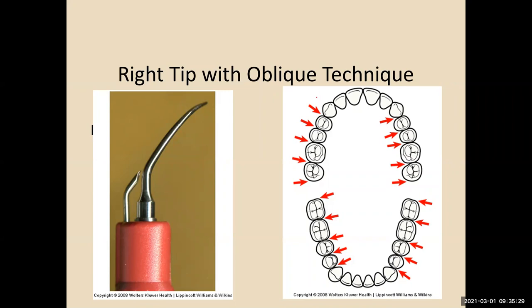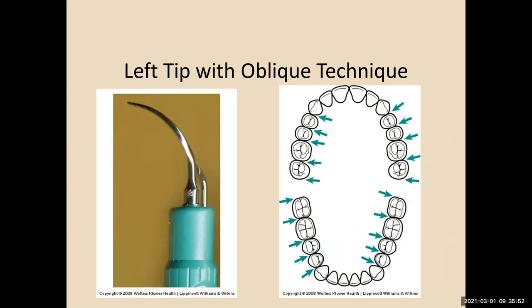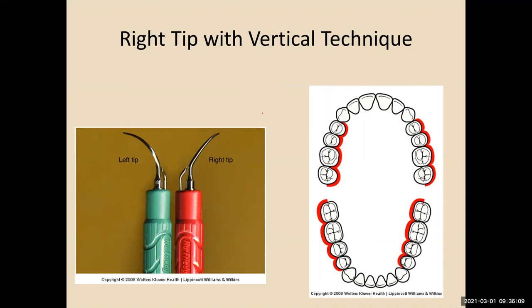So similar to your curette, if you can use it on the buccal of the posterior on one side, you can use it on the linguals on the other without having to flip it, like your universal curette. You might see some students have a poster or a little piece of paper that has the left and right to help remind them. Is it making sense? If you can use it on the buccal for one, you can use it on the lingual for the other.